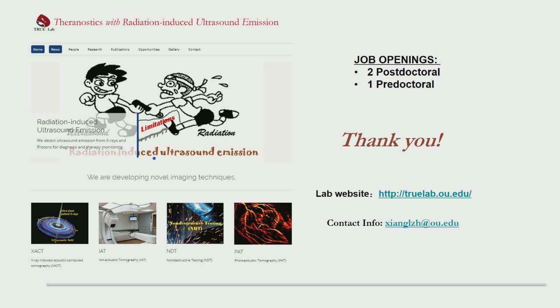This ultrasound wave propagates back into the tissue just like traditional ultrasound imaging, so you have mechanical information. So for the bone, you have bone density, mechanical information, and absorption information in 3D. So I don't know, people might be interested. That's just, we demonstrated on the laser, but we still work on the X-ray acoustic side.